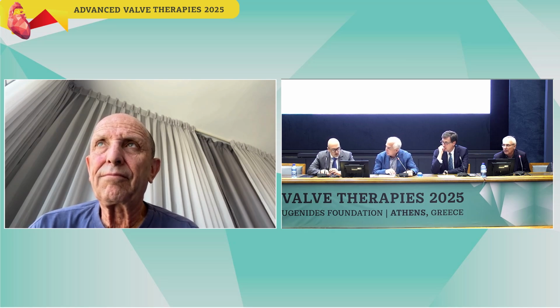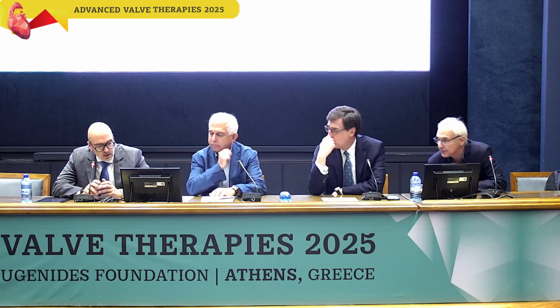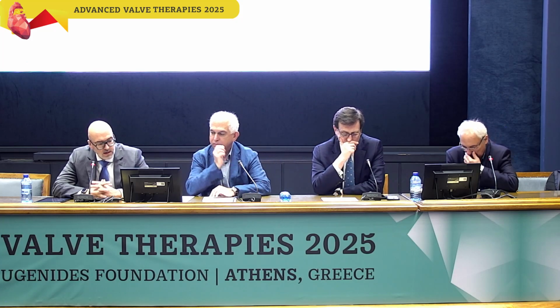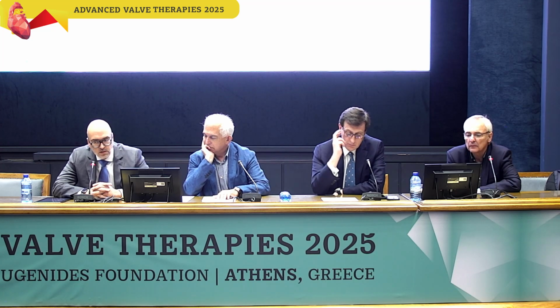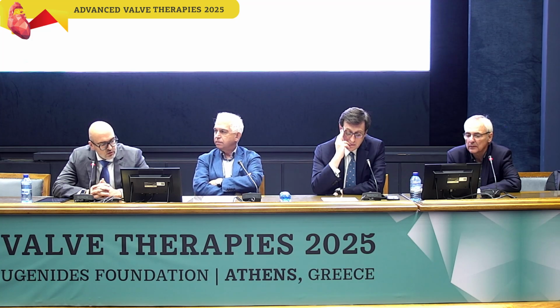Okay, Dr. Dimitriadis, can we have your comments? Yes, actually two different comments. First of all, a big discussion about the two valves. I think there is no comparison between the two valves. Both of them are fine for that situation. I think the big issue is which valve you feel comfortable and confident with to proceed in such a bicuspid case. There are a few technical issues.